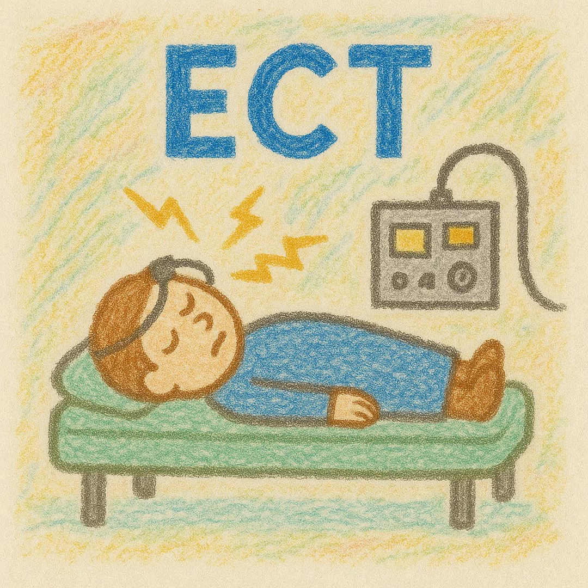The motor manifestations of the seizure, their actual convulsions, will typically end some period before the EEG manifestations of the seizure end. And then typically after that, they're going to start waking up because the anesthetic and paralytic are going to be wearing off because they're very short acting.